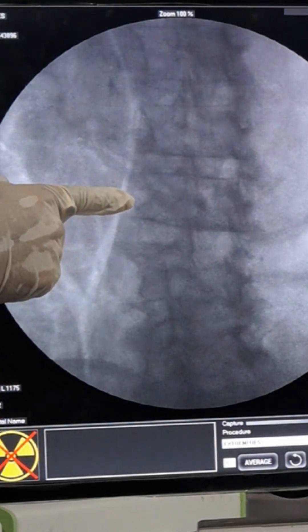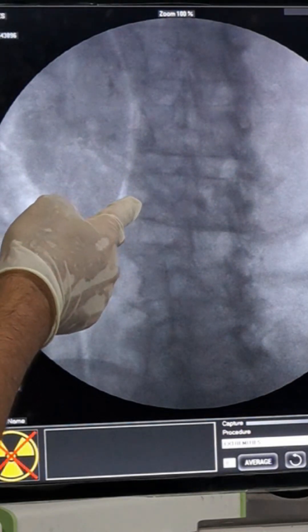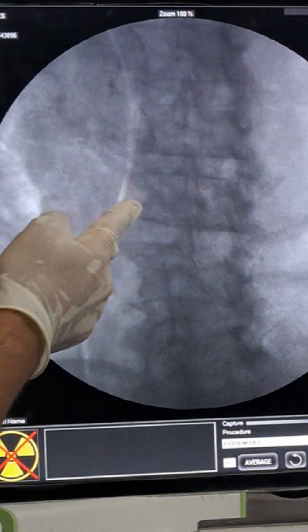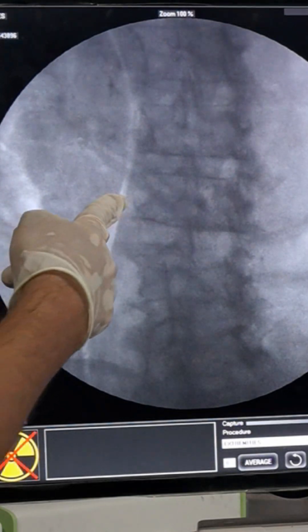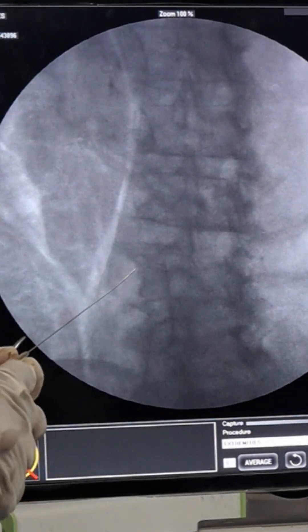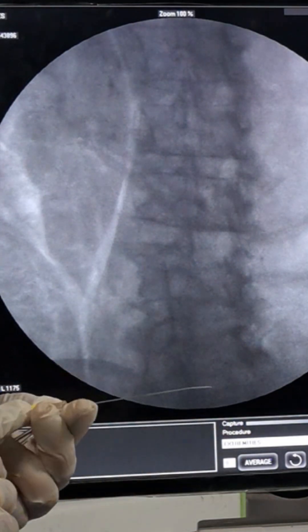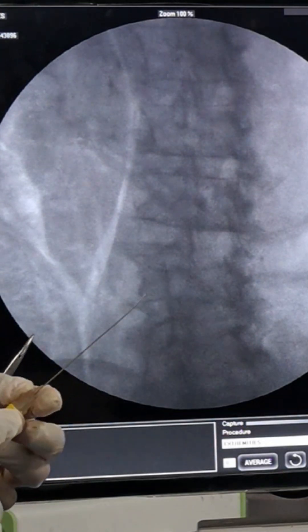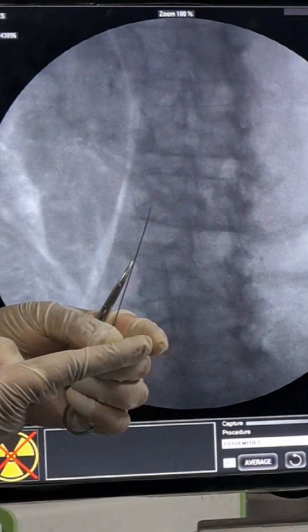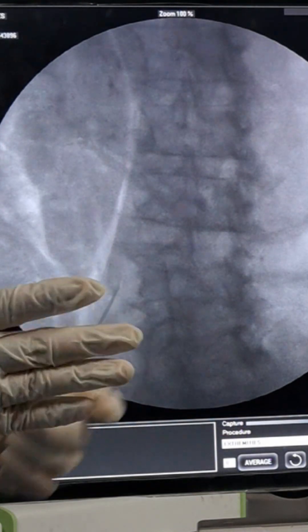My target is the lower one-third of the vertebral body. When taking the entry point at the skin, I should mark one centimeter lateral to this point. The reason is that the needle is bent — imagining the bend as half centimeter on each side, this one centimeter is your playing zone. If you take the exact target point at the skin, as the needle is bent it will go too medially or laterally when it reaches the target depth.